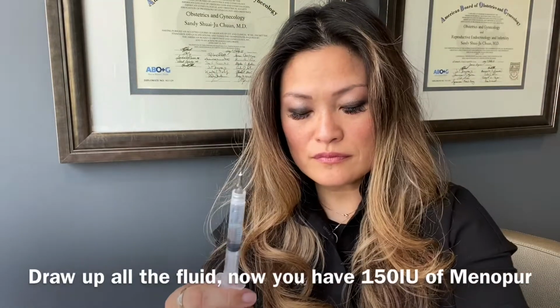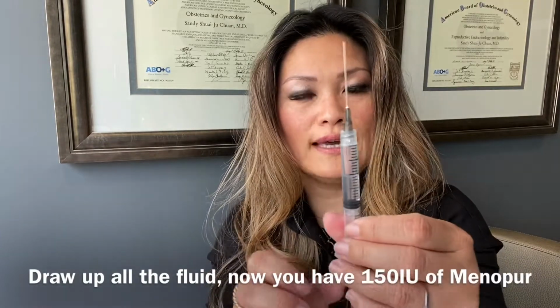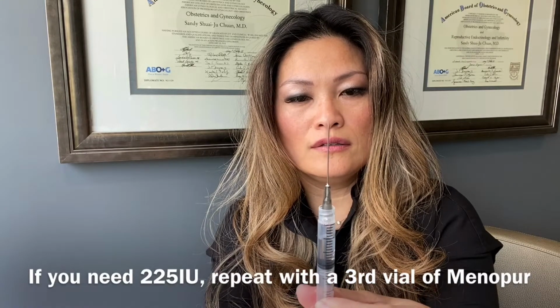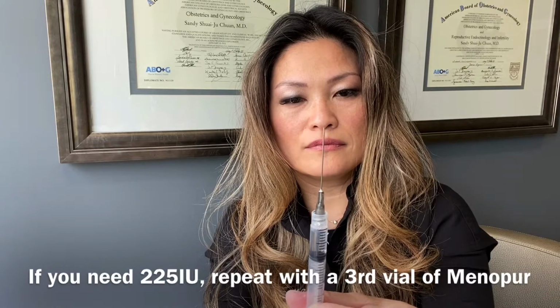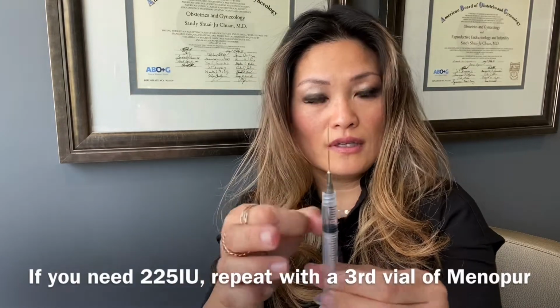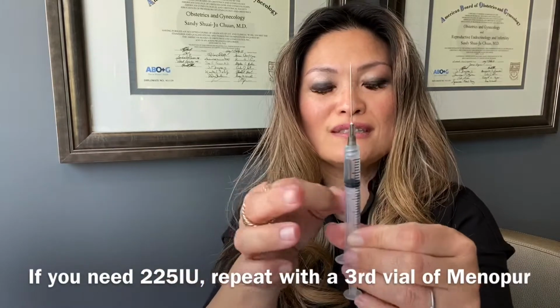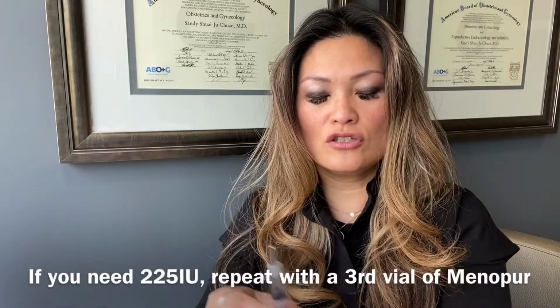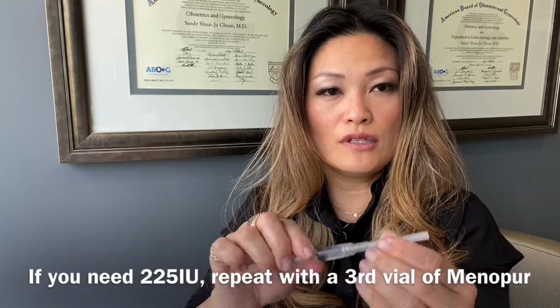All right, so now that that's all done, again, get rid of your air. Sometimes you might squirt out a little bit at the top, and that's okay. Just a little bit is okay. Okay, and then when you tap it like that, you always see it in the movies. It's because that'll make the air bubbles go to the top too and make it easier for you to get all the air out. So then again, carefully recap your needle, and then you want to take it off. I'm having a little trouble there. Remember to twist, and then you take the smaller needle and then twist it on, and that's it. Okay, and now that medication is ready for you to inject.